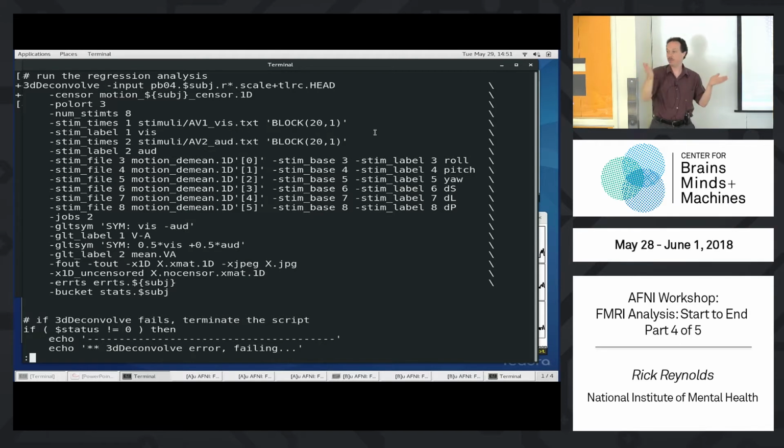And then the t statistic will be based on the variance explained by that. But still, the height of each response would be the same. That's in this simple case. You can do other things. You can have things vary over events or durations or whatnot. You can get complicated. I think Gang will talk about that tomorrow morning.